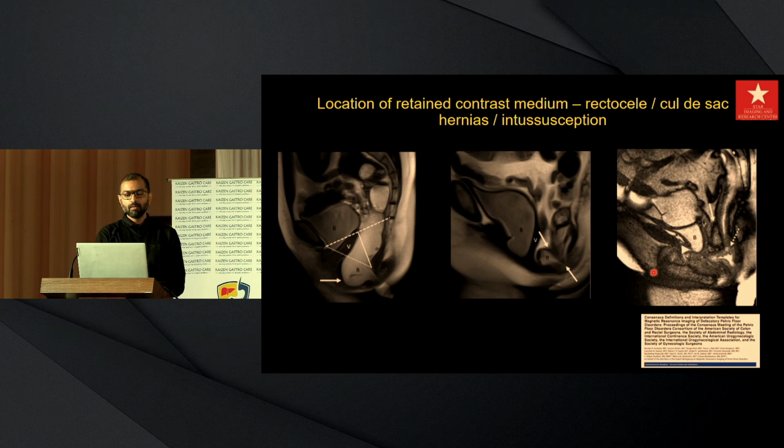Okay. So depending on where the bolus of gel, or the ultrasound gel, is retained in the rectum at the end of a study or the end of defecation, it could also give us some hint to what is going abnormal in the pathology. So that's the pubococcygeal line, the PC line, which is drawn from the inferior margin of the pubic symphysis to the last coccygeal articulation. What has happened in this patient during the attempted defecation and straining is the anorectal junction has moved abnormally downwards. Up to 2 centimeters is expected, but it is going much more below and it is increasing, basically indicating that the pelvic floor is much lax, going down.